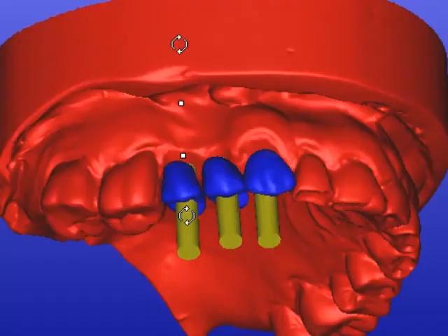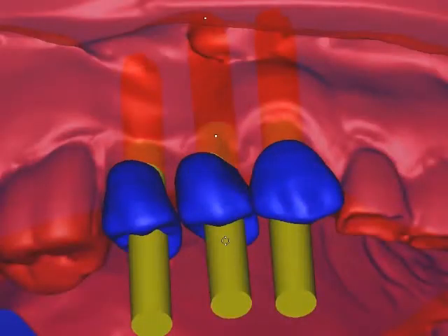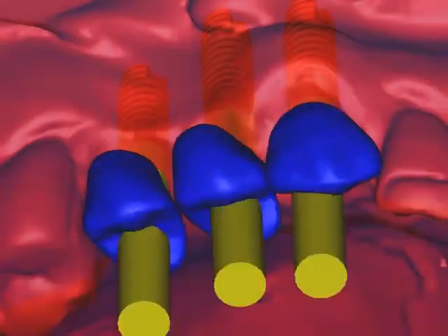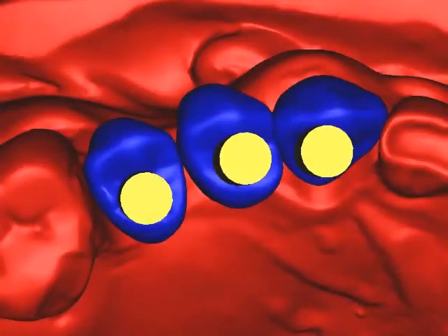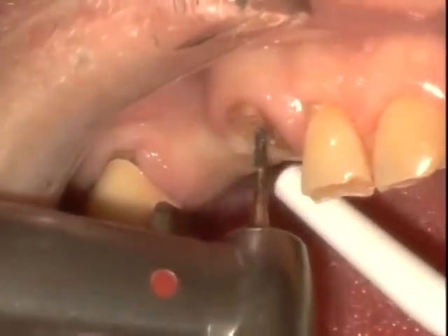So both things are going to be done in order to facilitate immediate functional loading of a segmental bridge. Here you can see the implants placed with the screw access channels directly placed in the areas of the future restorations. This is facilitated through optical scanning of the dental model and then combining that optical scan with the digital information taken from the cone beam image. This allows us to place the implants precisely where the future teeth are going to be with no guesswork.